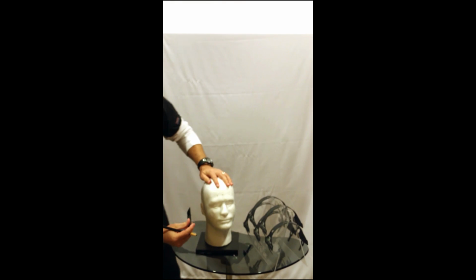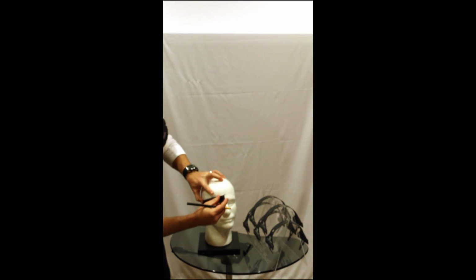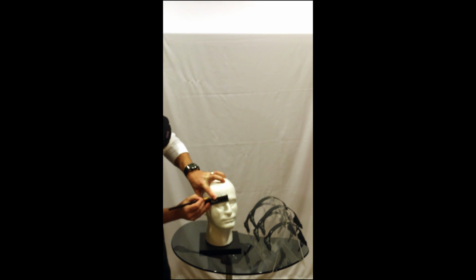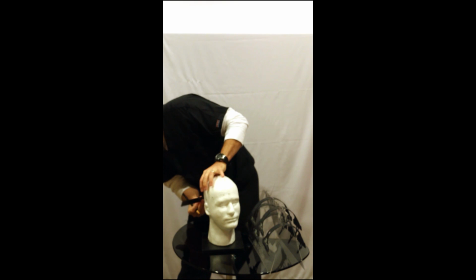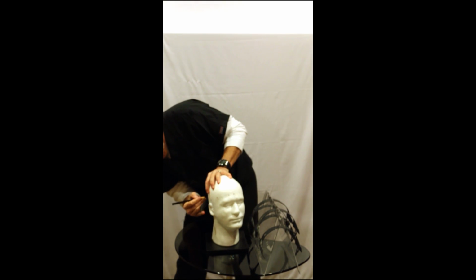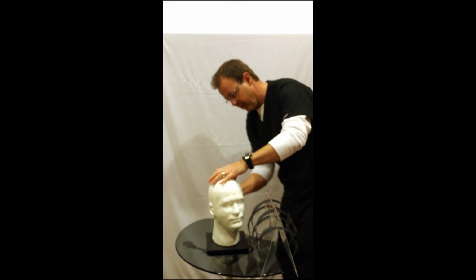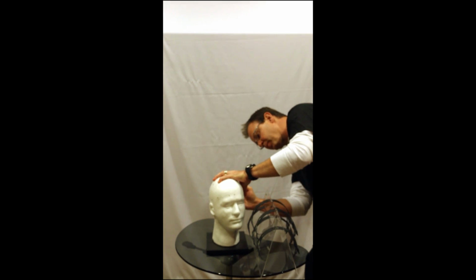Now, if I want to get my temporals, I can go from here to here. That's 11 centimeters, so 5.5. 11 centimeters, 5.5. 11 centimeters is 5.5.